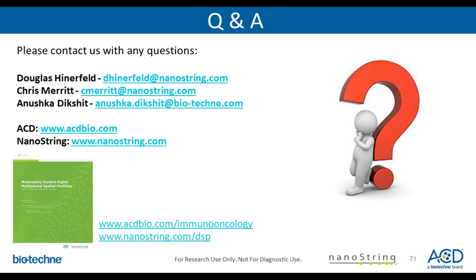So, Anushka, maybe the question is partly about detecting point mutations fluorescently? Yeah, so I was going to say that with RNAscope, we cannot really detect DNA, but we can detect mRNA targets, and for specifically point mutations, we encourage using BaseScope, which is chromogenic and not fluorescent. So you can validate your target expression, but not use it for ROI selection.